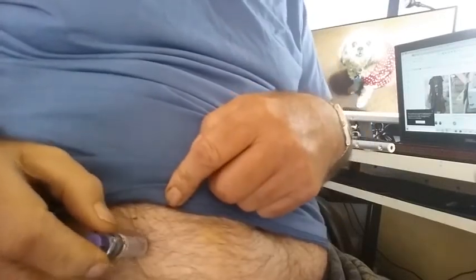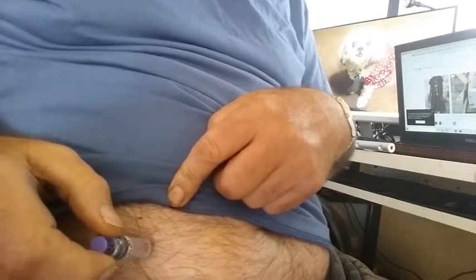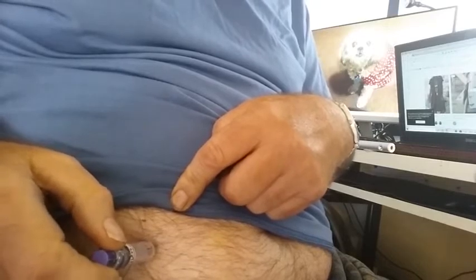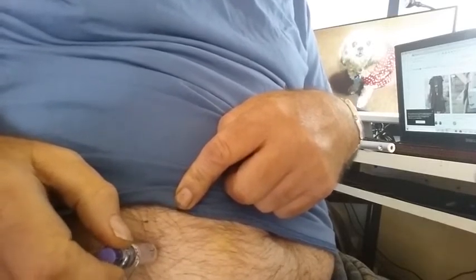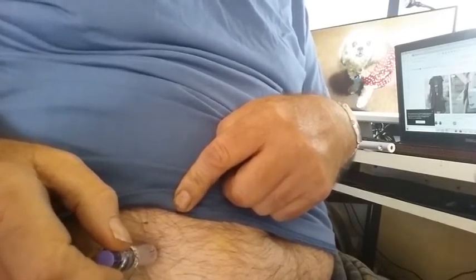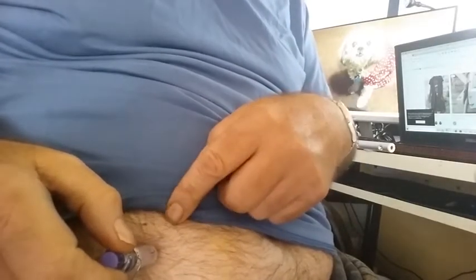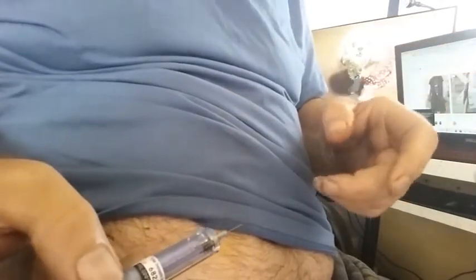I'm letting it sit for a minute and pulling it out. You don't have to worry about the air bubbles in there because you're using it subcutaneously. I can't even pronounce the name. You know, it's putting it in your soft skin. If you were putting it in a vein, you'd want to get the air bubble out of that.